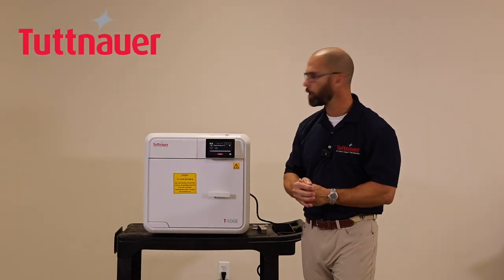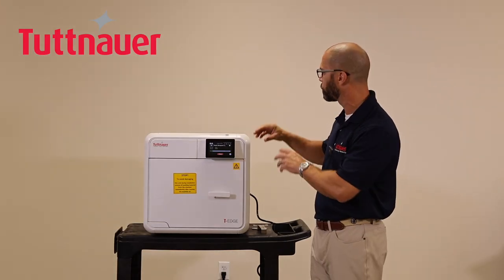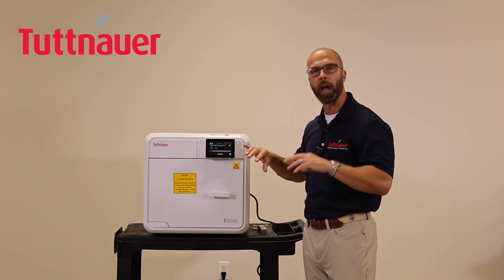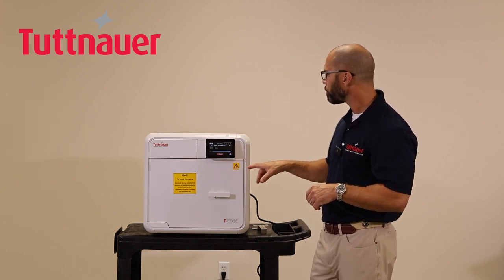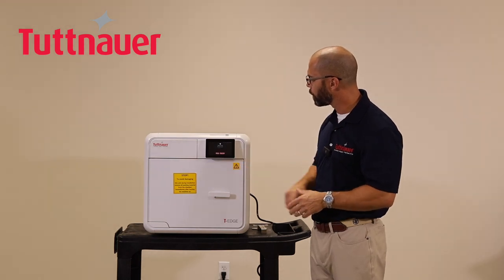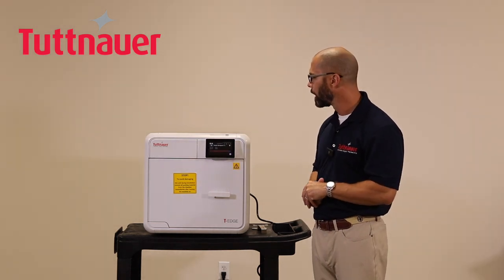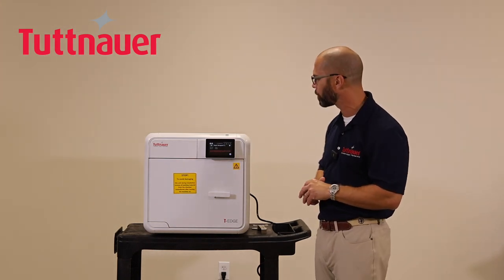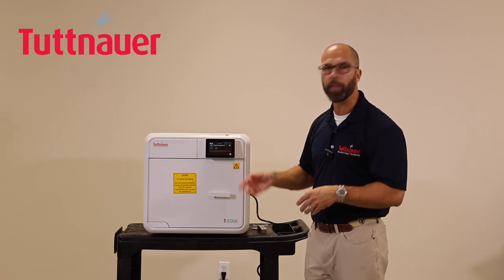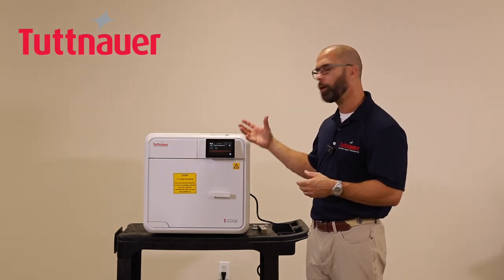Once started, a status display develops on screen and you'll hear the machine begin removing air from the chamber as it prepares for the sterilization cycle. If you need to abort the cycle, simply press Stop and confirm — the machine will depressurize and shut down. It takes a moment to complete the shutdown, and the display will show a cancellation message indicating it was cancelled by the operator.